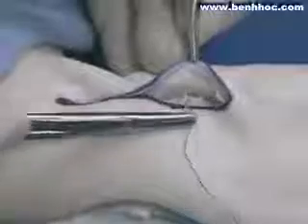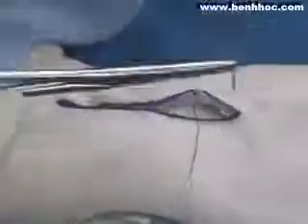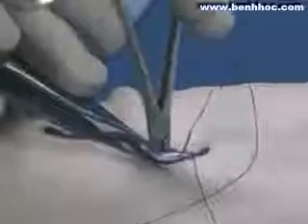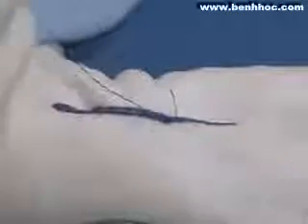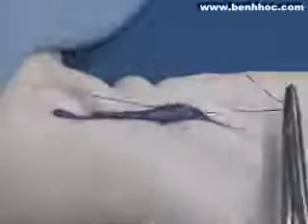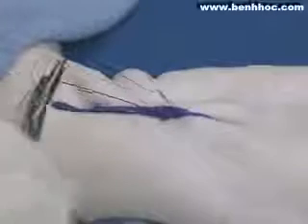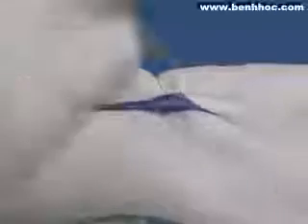A second deep suture is placed according to the principles of halving, midway between the first central suture and the end of the long axis of the wound. Again, an instrument tie is used to fashion the square knot. Four throws are used to be sure that the knot is secure.